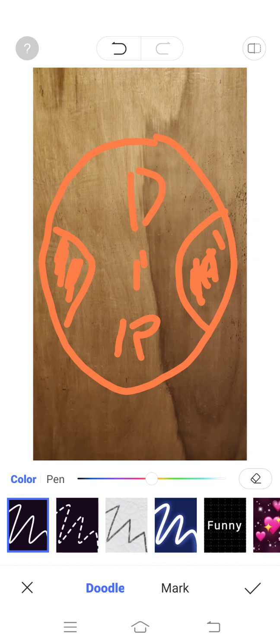So meaning if you are looking at far, you use this area here. When you're using your intermediate vision, you're using this area here. And when you're reading, you're using this area on the downside. Okay, but if you move your eyes from left to right, your eyes will hit the sides.